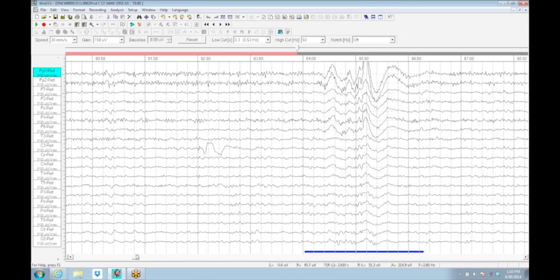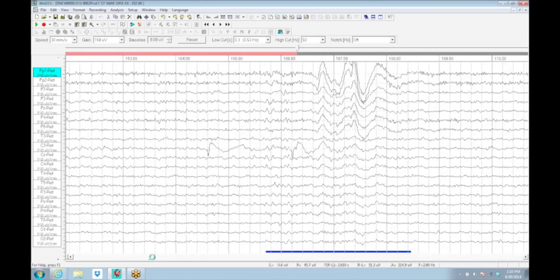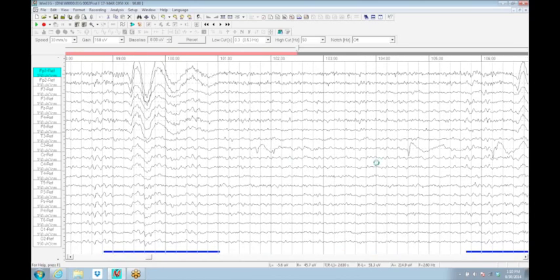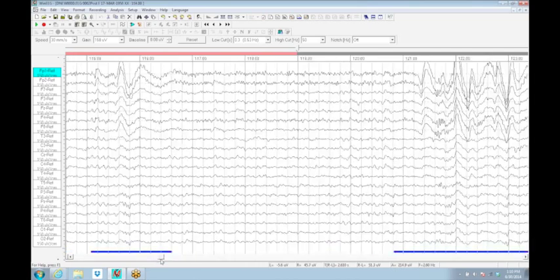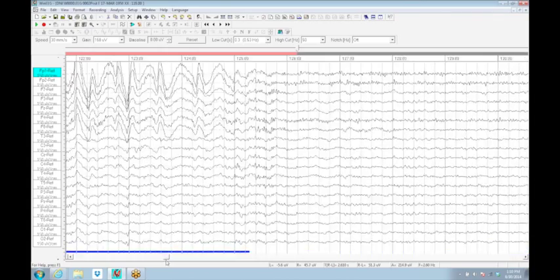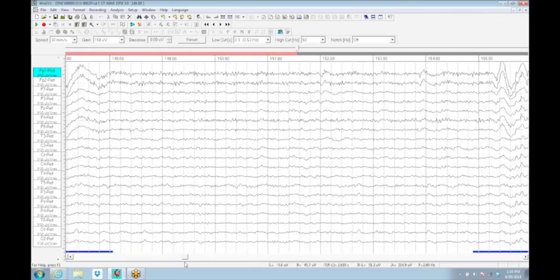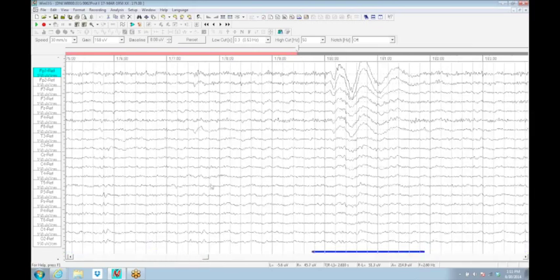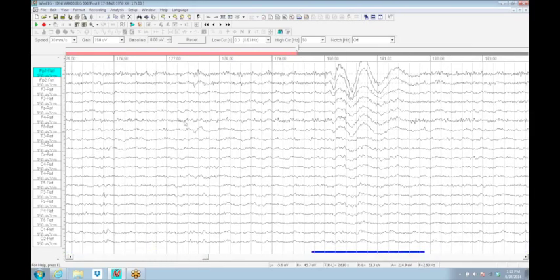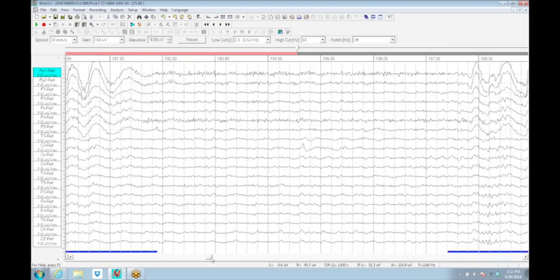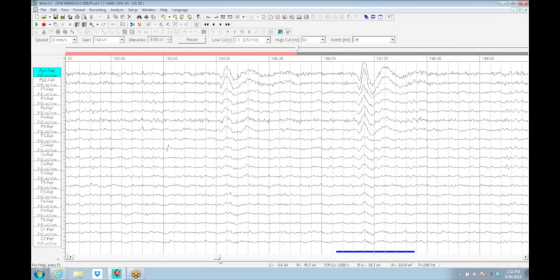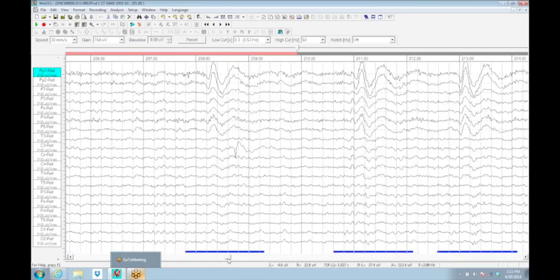There are pieces being left in here that you're not going to want to leave in. This essentially has a C3 electrode that's popping throughout. That F8 electrode that popped originally has some instabilities as we go through. This is the more traditional marking of pieces that you'd want to throw out. We'd want to mark all of these to do a good job of it.